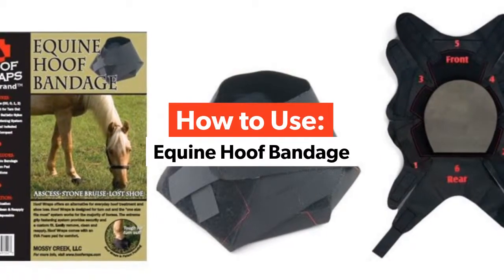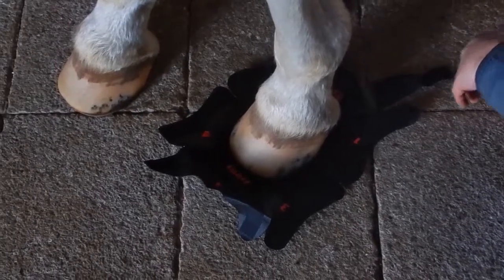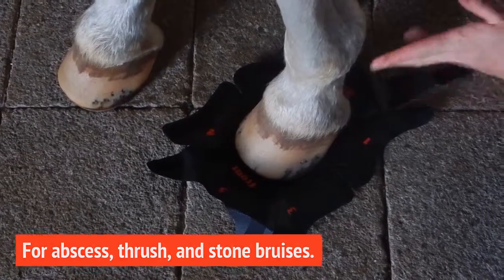Hoof Wraps bandages can be safely used for common hoof care situations such as abscesses, thrush, and even stone bruises. The bandages can also be used to protect the hoof after a shoe loss.